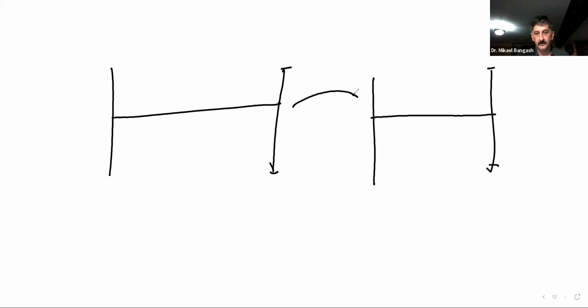That's the difference between the two. Increase the Nyquist limit so it goes by hundreds. So that was increasing the PRF, that is how we increased the Nyquist limit.